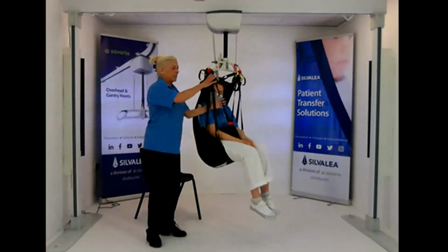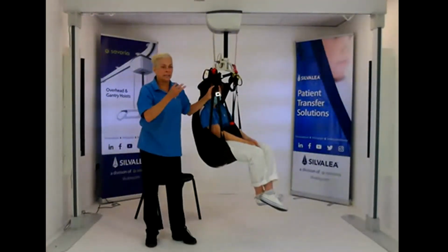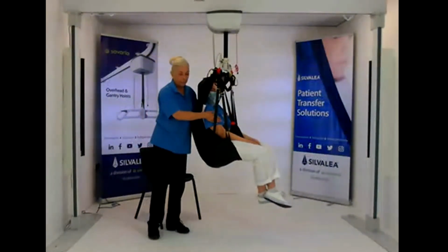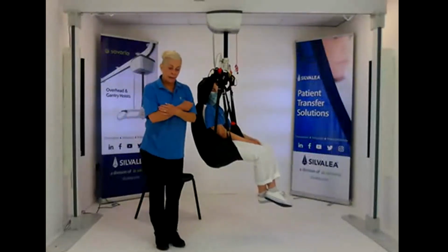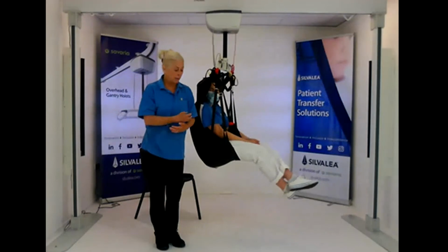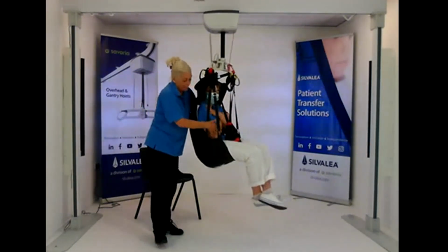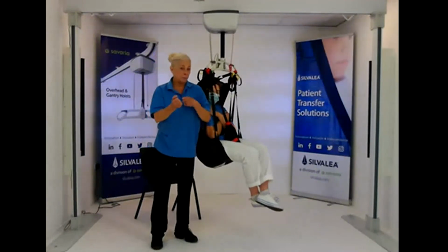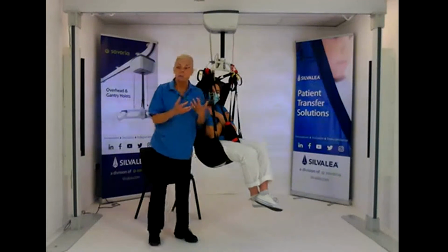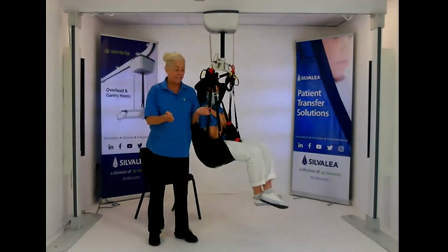Somebody wanted to just keep pulling at the tapes and fiddling and getting tangled up. So we've made a little wrap that went around and enclosed their arms. Velcro soft toweling wrap. You put your arms around your chest across there, and it just kept them. There was movement. It allowed them to move, but it meant that they weren't getting tangled up. So it was sort of safeguarding them from tangling up and from lashing out and hitting carers.